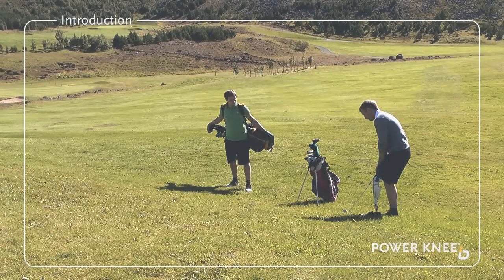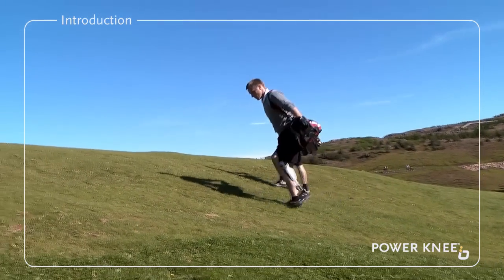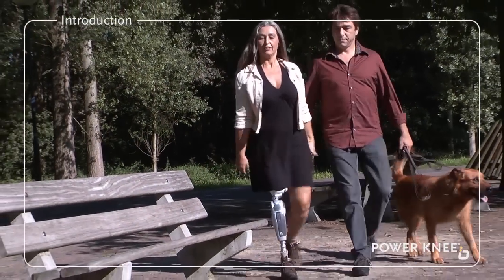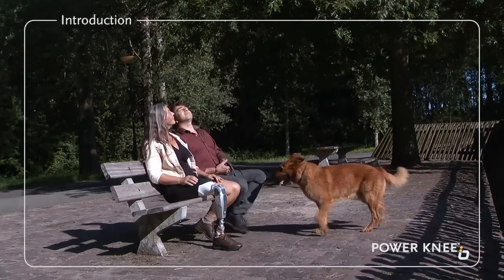This short DVD will help you understand how to use the Power Knee properly and feel confident and secure throughout your day. We suggest you watch it more than once over the coming weeks to really master the functions of the knee and get the most out of it.